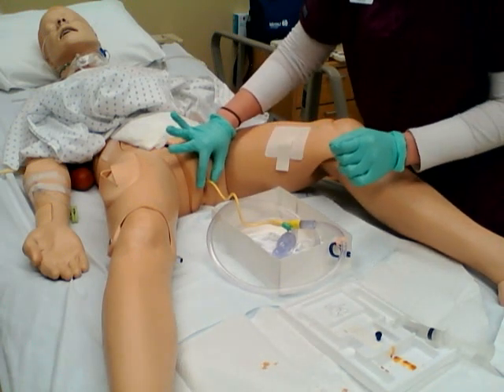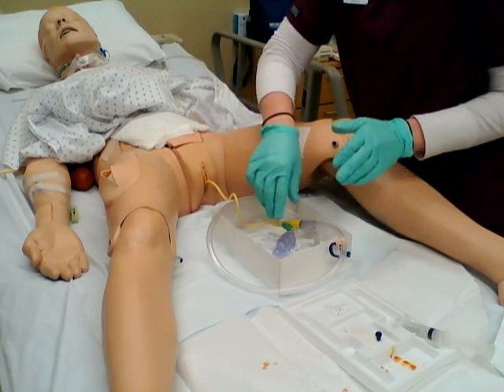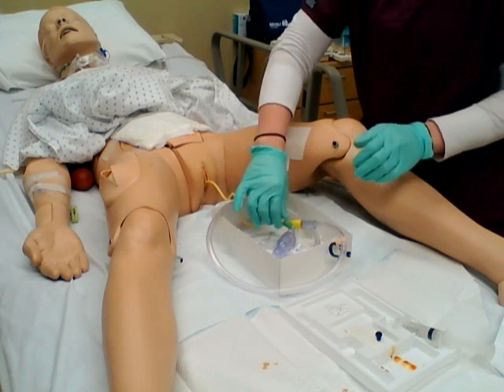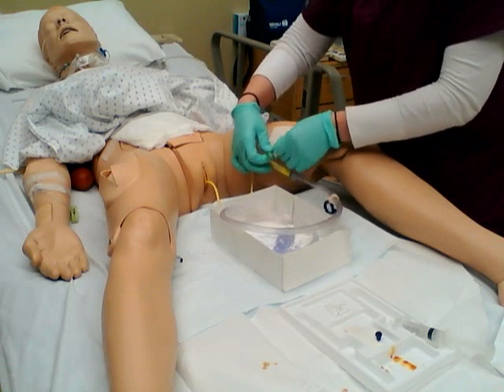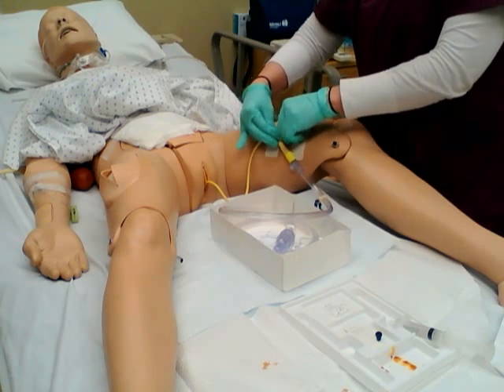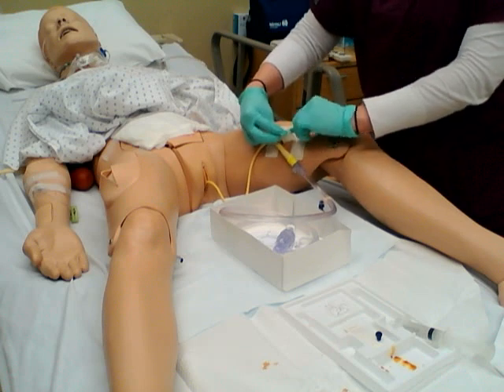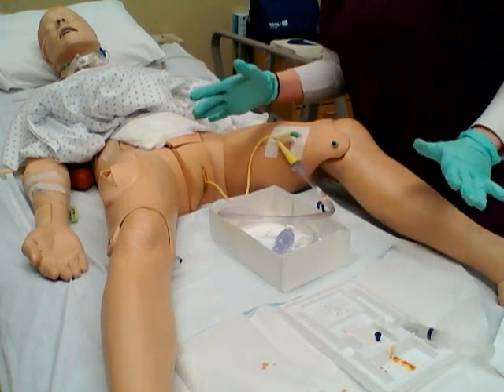So now once that is done, you don't have to worry about keeping the field sterile anymore. So I'm going to attach this. I forgot a very important step.